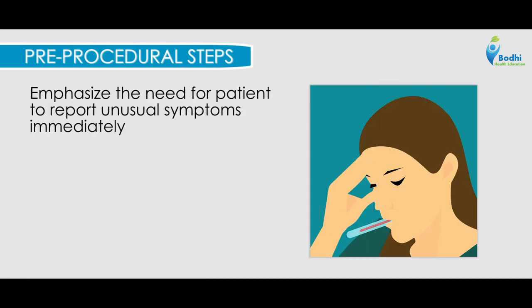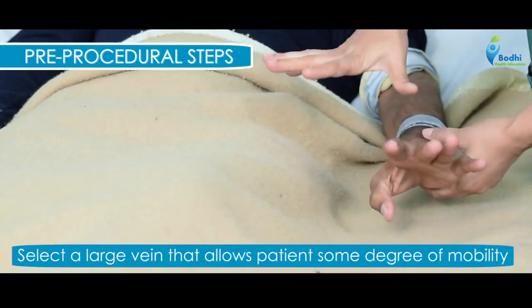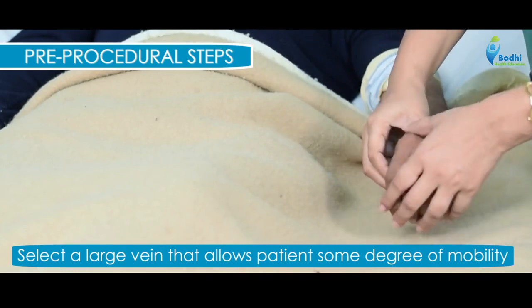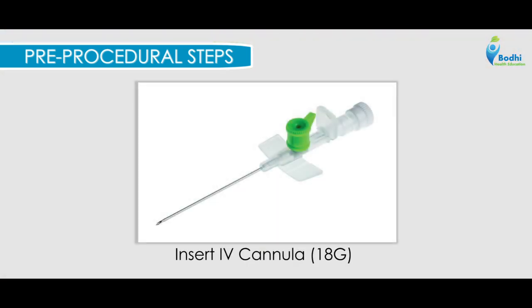Emphasize the need for patient to report unusual symptoms immediately, that is chills, headache, itching or rash. Early identification of transfusion reaction aids in instituting prompt corrective measures. Prepare infusion site. Select a large vein that allows patient some degree of mobility. Insert IV cannula, that is 18 gauge.